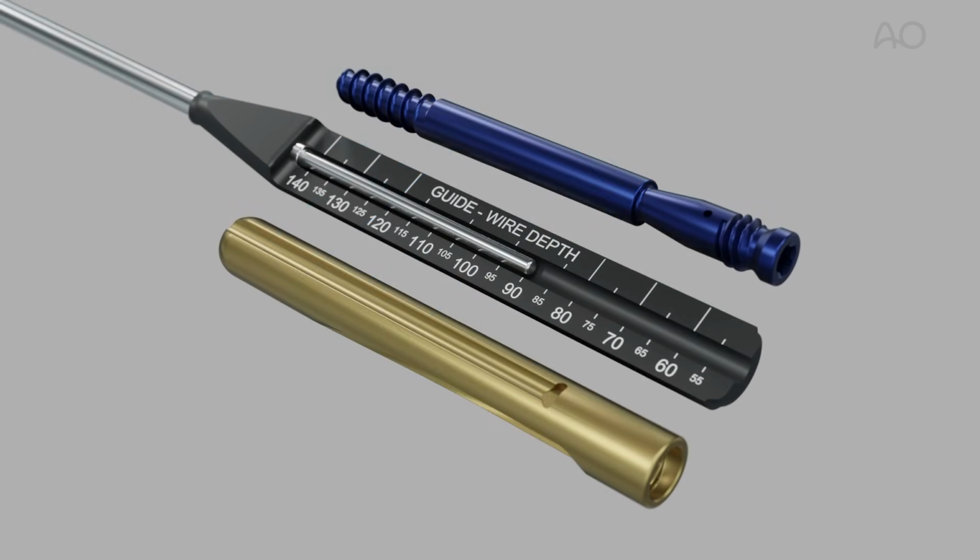Note that, if using the pre-collapsed technique, the drill length and anti-rotation screw size must correspond to the size of the bolt.